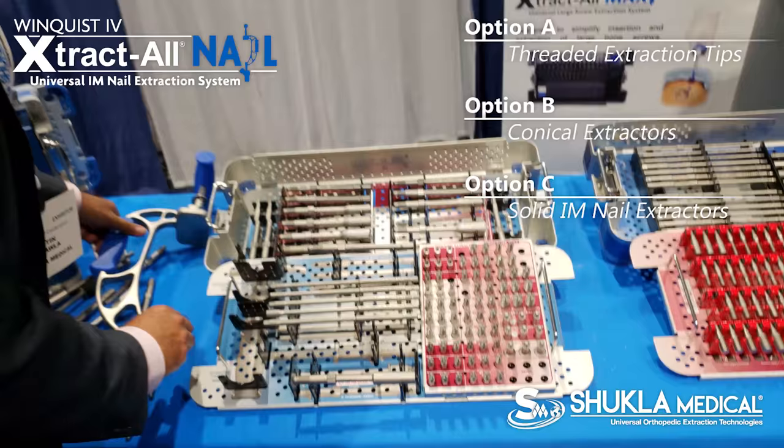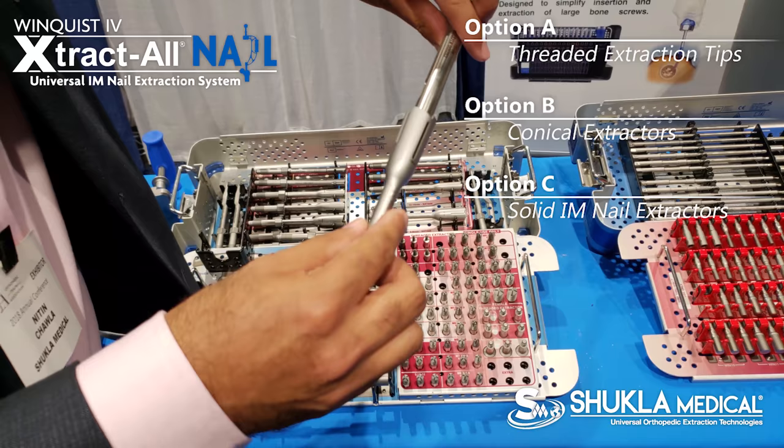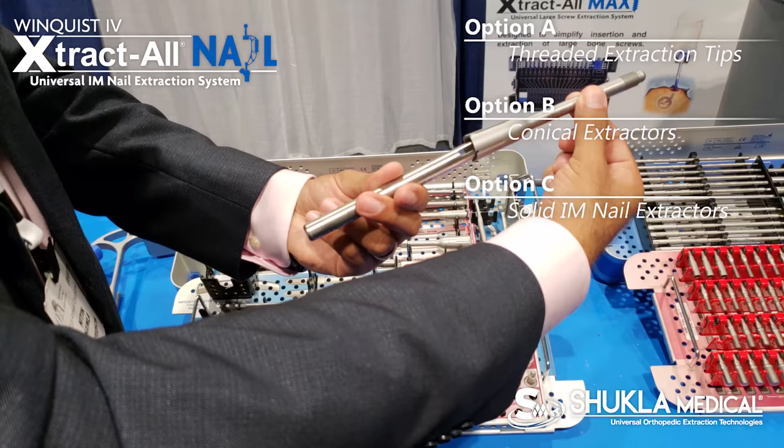Or Plan C — the third option — which is a solid IM nail extractor. The solid IM nail extractor goes on the outside of the nail and creates its own threads on the circumference of the shaft.